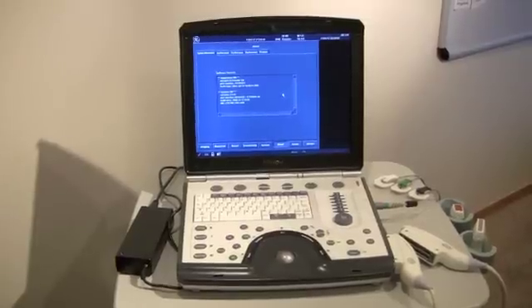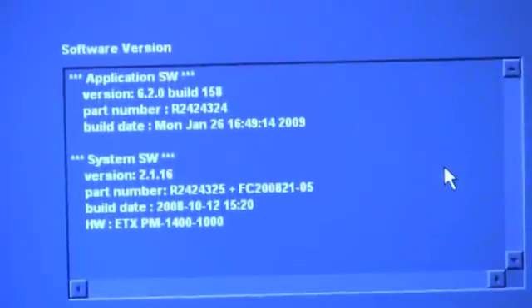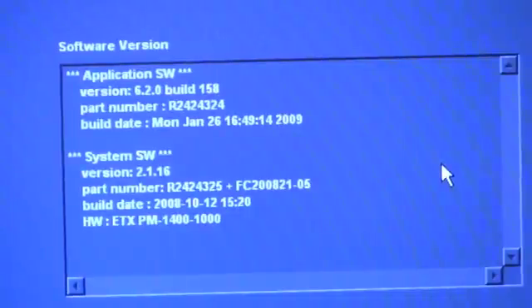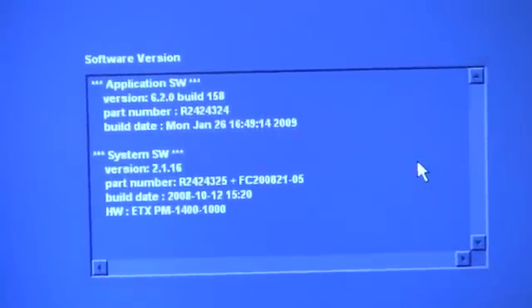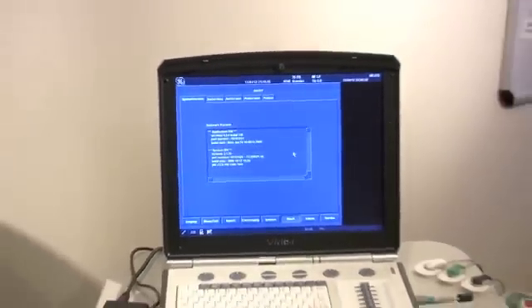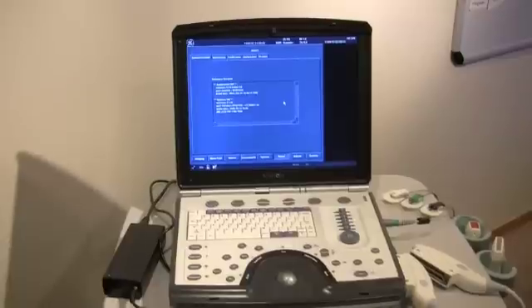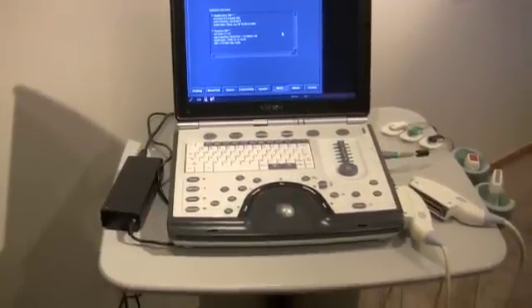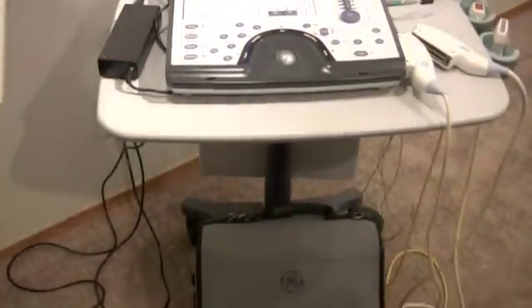I want to show you the build and the software so that you'll see those. There are the details on the system itself. The system also comes with a cart and a carry bag, and I'll show you those. Then I will demonstrate the probe so that you can see that it is functional and working properly. There's the cart, and there's the bag.